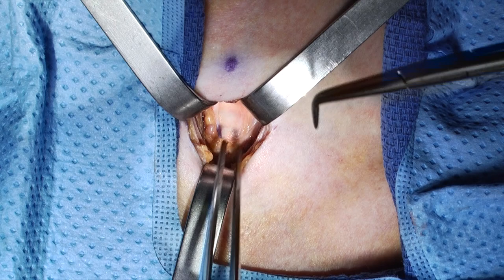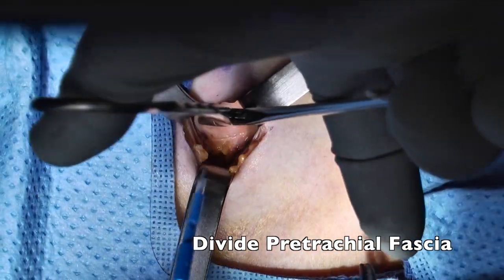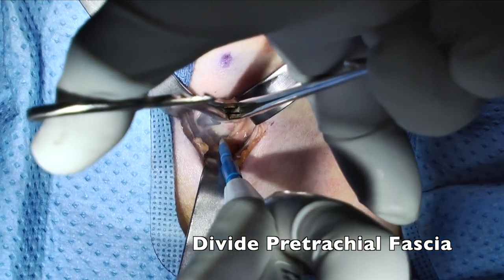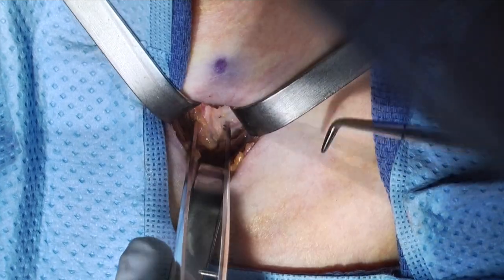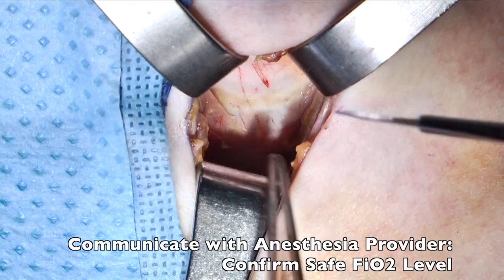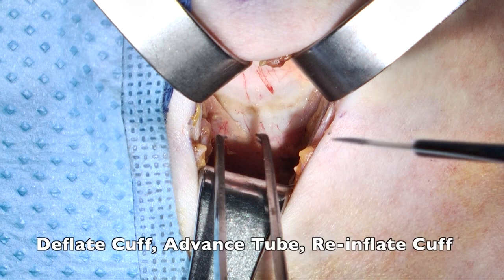The pretracheal fascia must be divided. To do this, a right angle is utilized to get right on the trachea, and then using a 90-degree turn as visualized here, the fascia can be divided. Once the airway is appropriately visualized, it is important to speak with the anesthesia providers to ensure that the FiO2 levels are a safe value to prevent any potential airway fires.